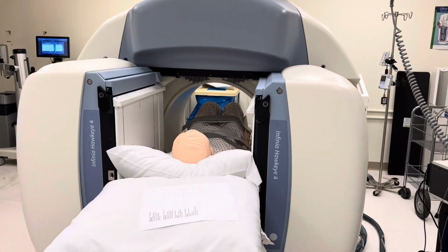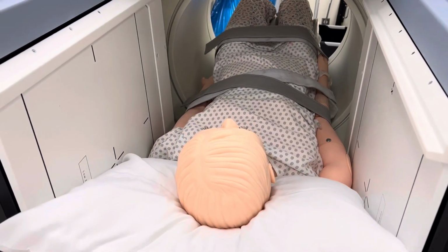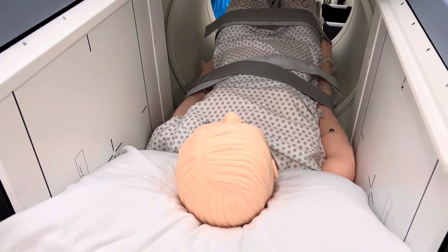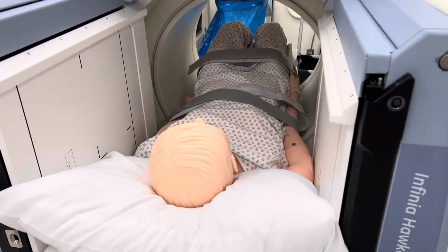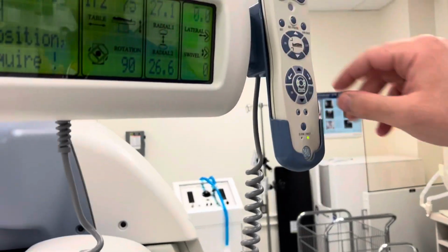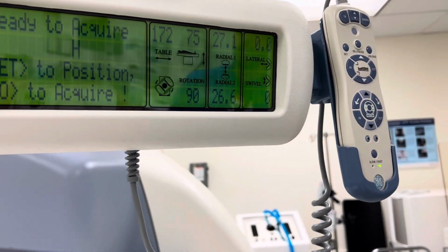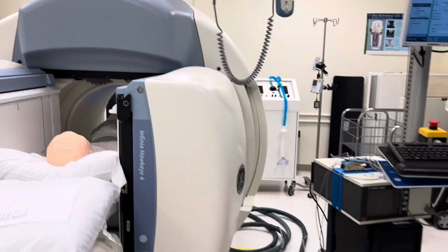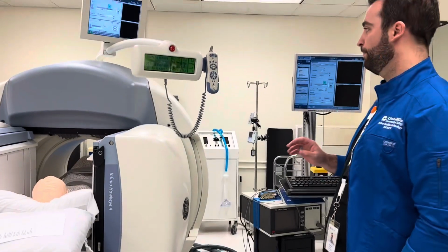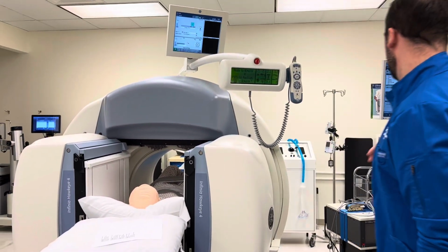Okay, so now we're in position. We're as close as we can get to the patient. The patient's head is in the middle of the field of view. And then I would hit enable go to start pictures. And again, this static would probably take around 5 minutes to complete, at 500,000 to a million counts. Okay, Rosie, so that picture is done. We're going to go into the whole body picture now.